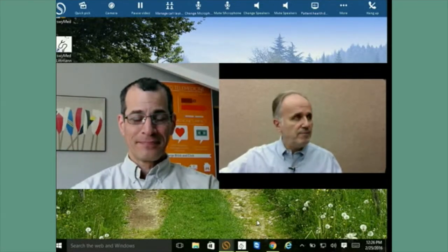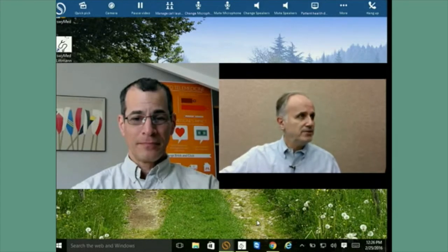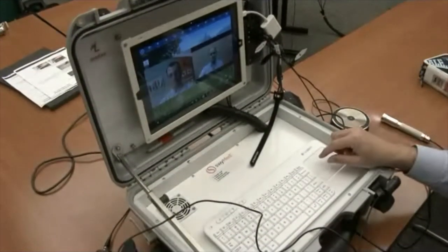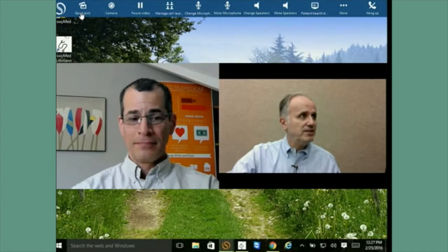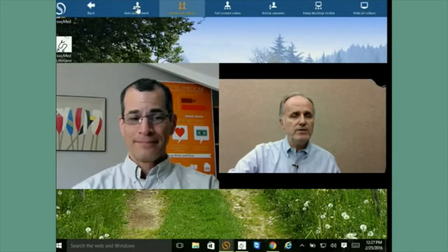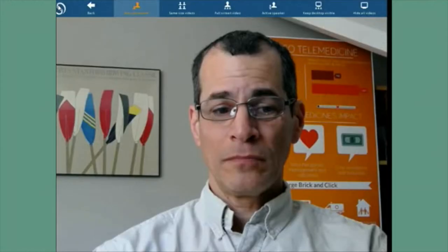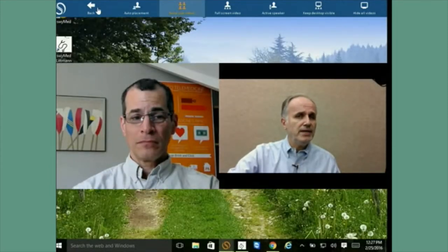This is basically what happens during a normal visit. The doctor gives instructions, selects the video cameras, tells you when to connect the stethoscope, and listens. If you want to make the doctor's video larger, there is a 'manage call layouts' button. Select 'auto placement' to put the image of the doctor large on screen. Because the video covers the toolbar, right-click the mouse to bring the toolbar back. You can then go back to same-size videos.